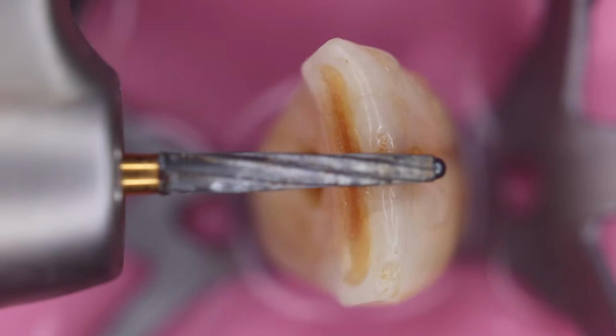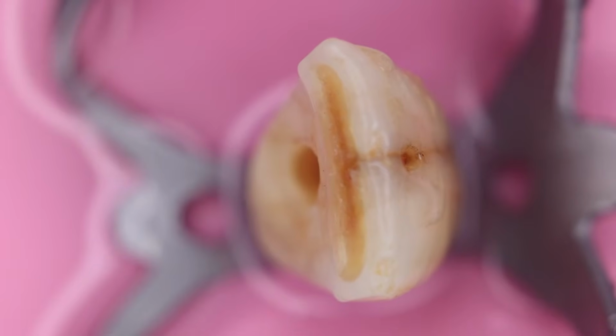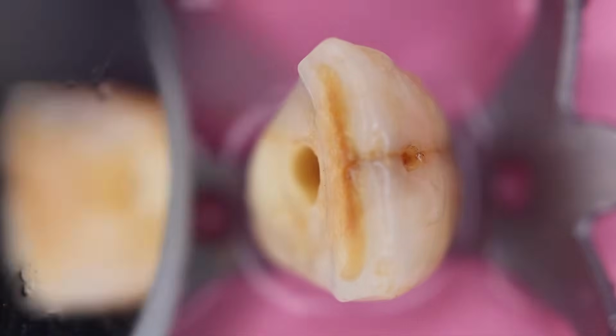So over here we have the AtoZ bur, and now we are shaping the access cavity. We have already gained access into the root canal, and we are shaping this access cavity so that we have a straight line access.